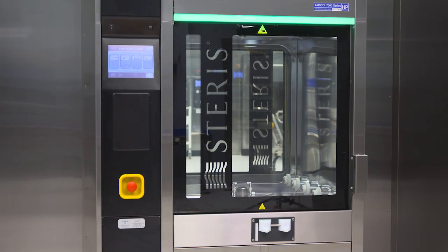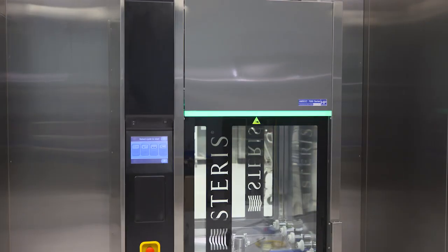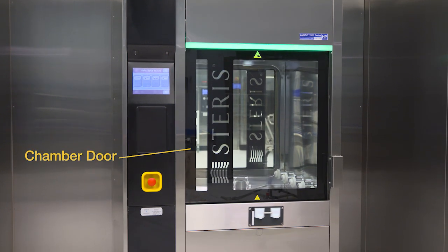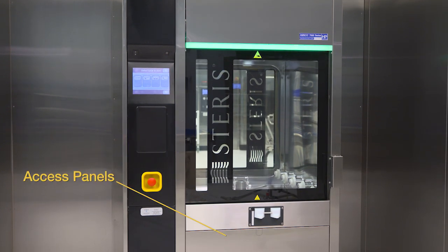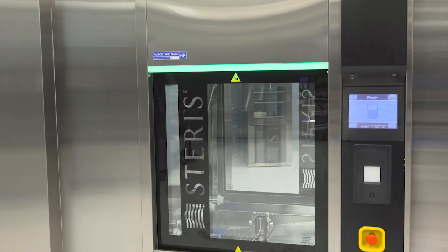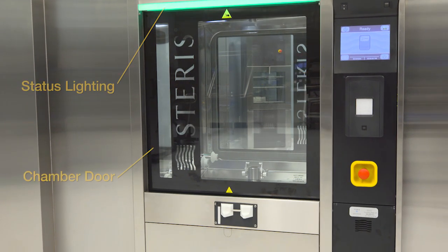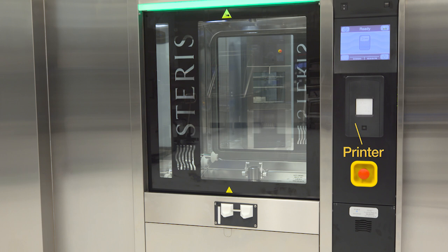Before operating your AMSCO 7052HP or 7053HP washer, become familiar with the major components and controls. These washers feature an ergonomic design and easy-to-use control screen. The load or dirty side features a control screen, chamber door and lights, and access panels for performing maintenance. The electrical supply switch is located above the control screen. The unload or clean side has a control screen, chamber door lights, a second chamber door, and a printer for documenting each cycle.